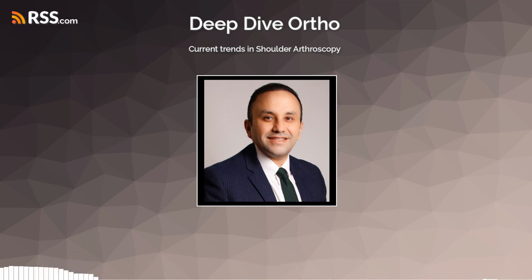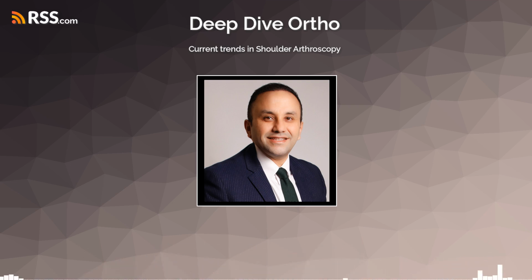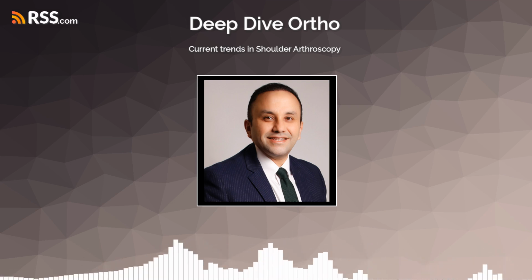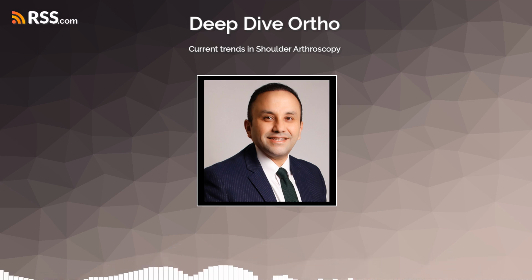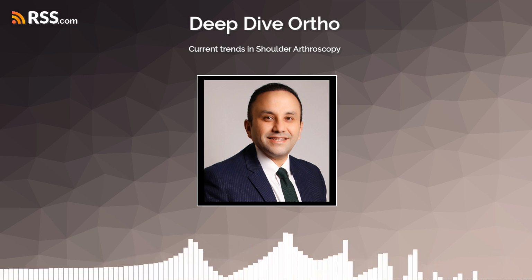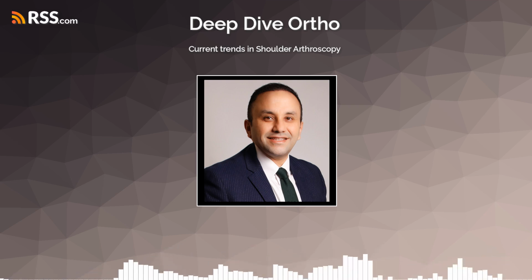What's released? Traditionally, this involved open surgery, often removing the first rib. However, endoscopic techniques have been developed as less invasive alternatives for releasing structures that can cause compression. This might include releasing the scalene muscles in the neck, scalenectomy or scalenotomy, or releasing the pectoralis minor tendon in the chest if those are identified as the compressing structures.